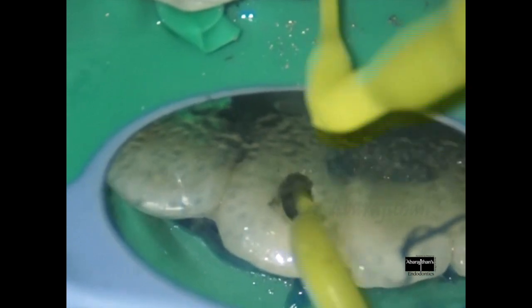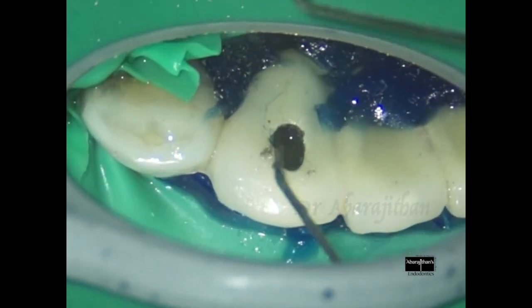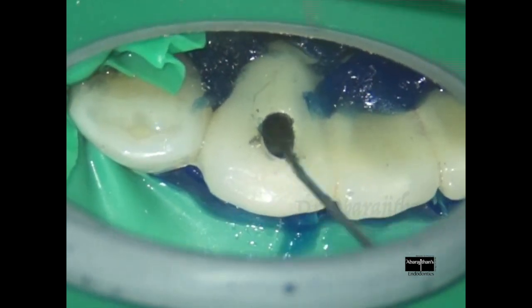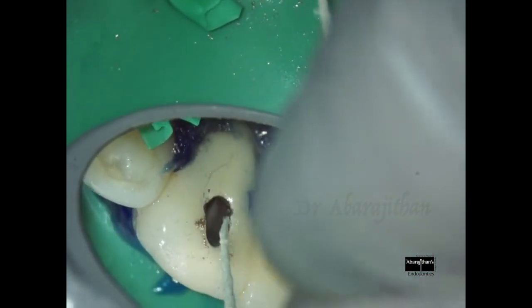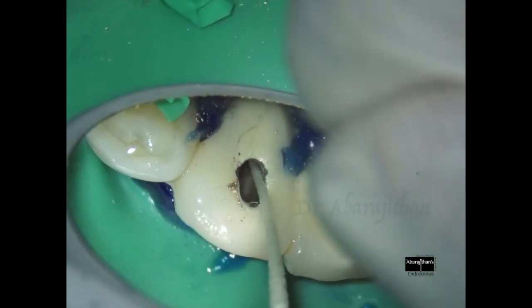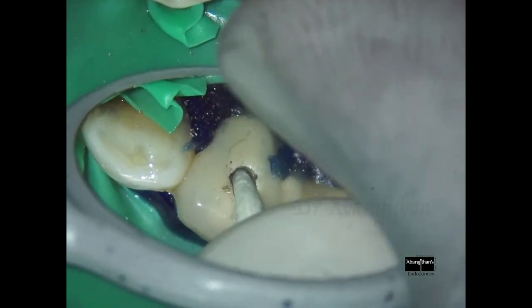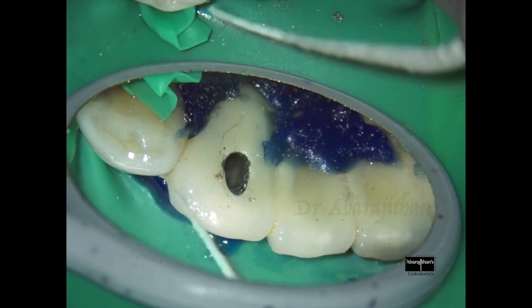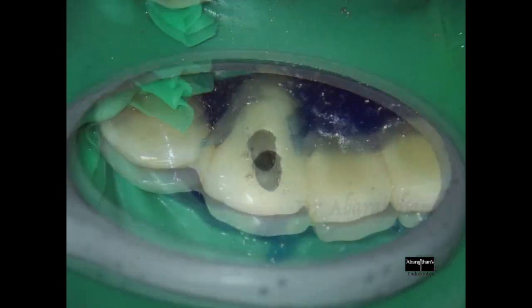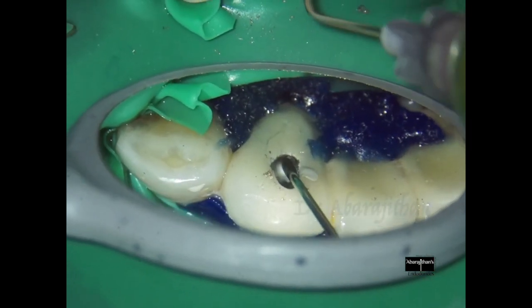Agitation is very important for good disinfection of the root canal. You can see the canal is dry and ready for obturation. This is my canal drying protocol: I first aspirate the canal with a needle, then I use my paper point — usually it is just a single paper point. But this case being a draining canal, I am using a second paper point as well. You can see the first paper point was wet but the second paper point is dry. My indication for single visit endo is: if I can dry the canal, I fill the canal in single visit.